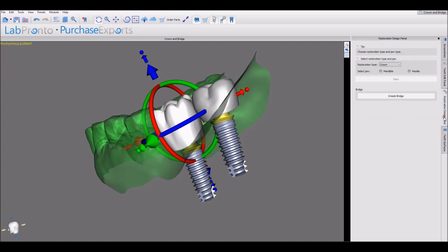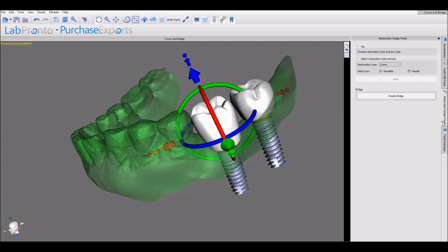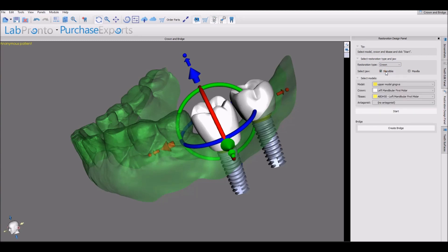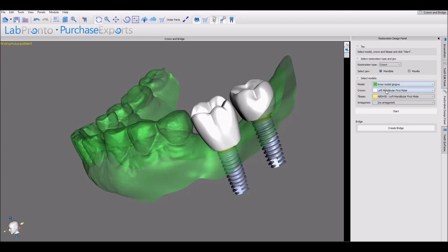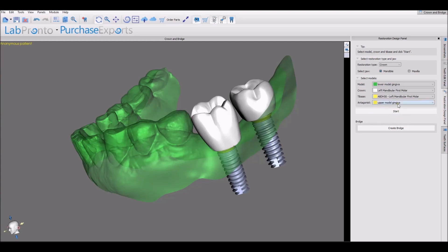Once we have our teeth placed and designed, creating the restoration is quick and easy. We're going to make sure we're in the Restoration Design panel. The restoration type should be set to Crown. Select the relevant jaw. Here we need to make sure that we have the correct surfaces and options selected correctly — the correct model, the crown for the first molar, the tie base for the first molar, and the antagonist as the upper model. Then press the Start button.